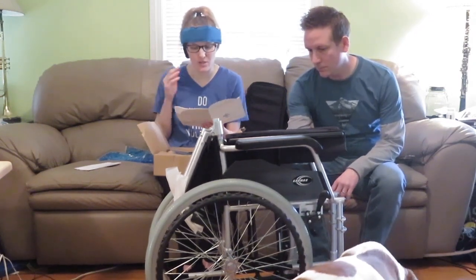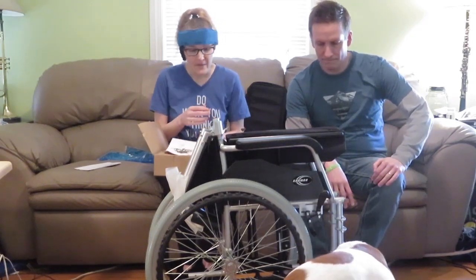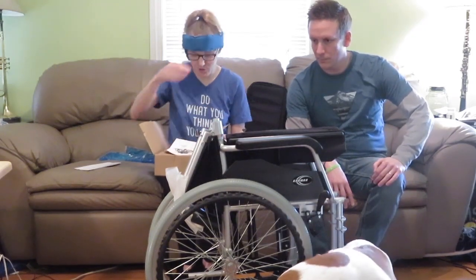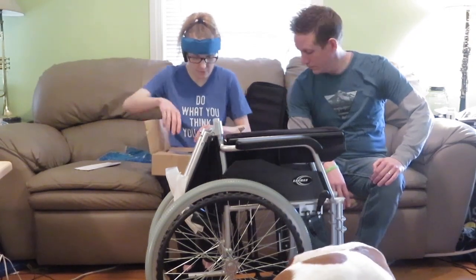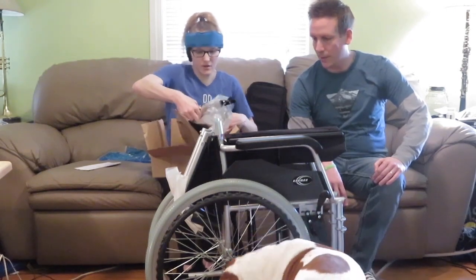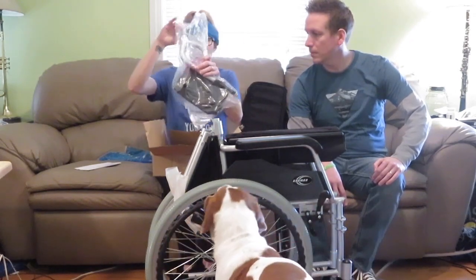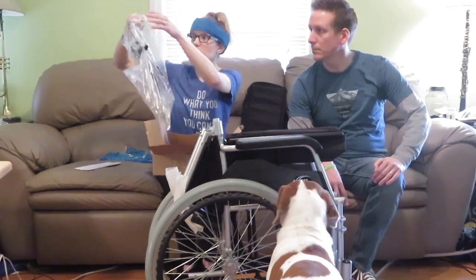This is basically an unboxing where we'll show you how it works. I've seen some assembly videos that Roger hasn't, so I'll be showing him as we show you all. Let's see what else is in the box — here's a manual if you want to be familiar with the design. And here are the footrests.